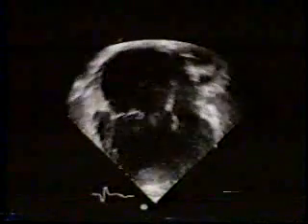The atrial septum was intact, left AV valve was normal. The main ventricular chamber was dilated as well. Watch these findings in real time now. The very abnormal right AV valve can be clearly seen. Color flow examination confirmed the presence of severe regurgitation of right AV valve.